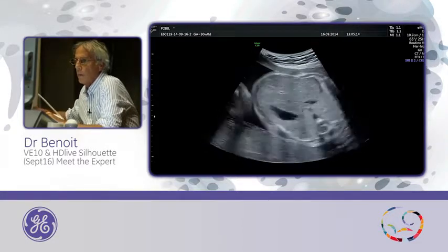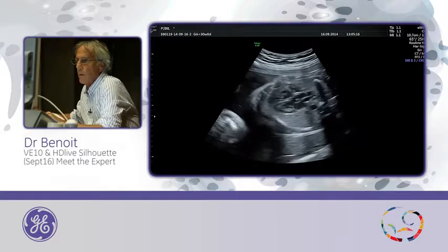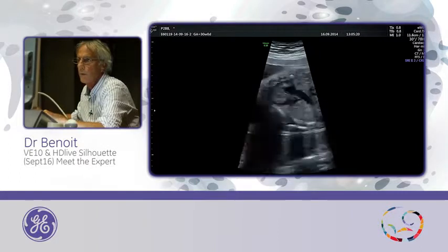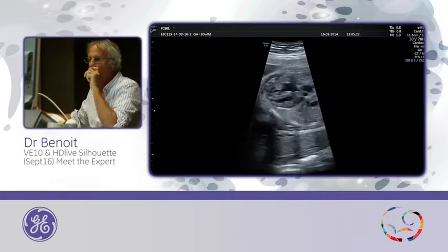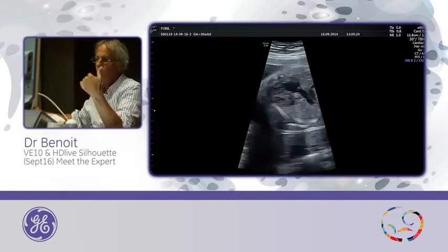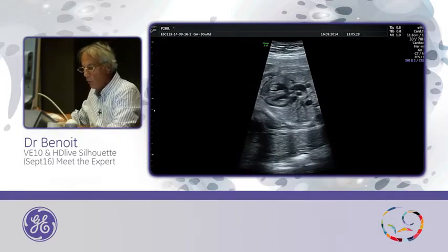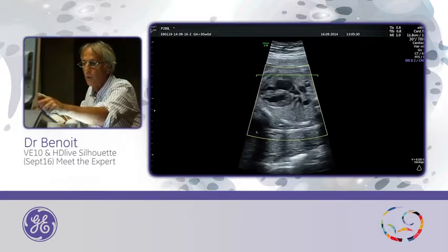So what else can I do? Maybe we can do a real-time 4D on the fetal heart when you have the four-chamber view. Yes, so I will go with the cardiac settings here. This is a cardiac setting. For the heart, you can do a 2D examination.